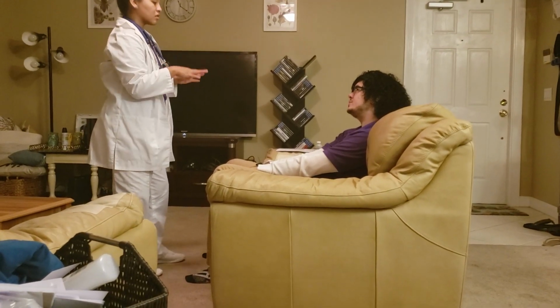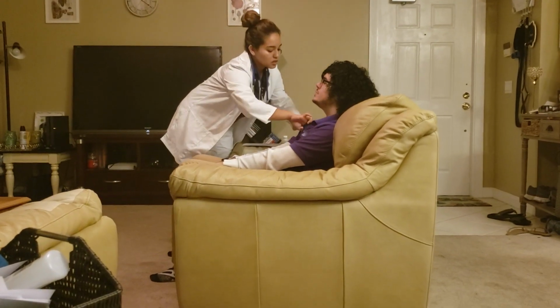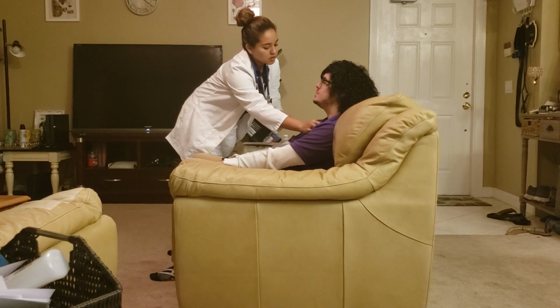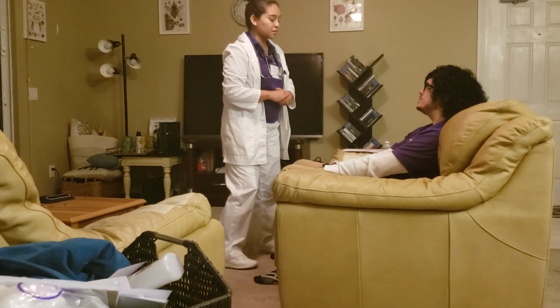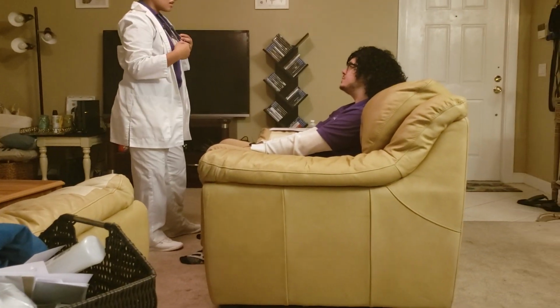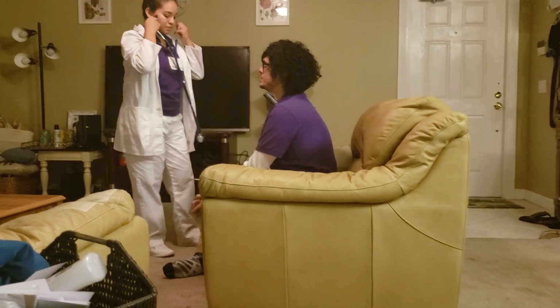limits. So I'm going to go ahead and move on to your chest and inspect your chest and skin turgor as well. Chest is normal, symmetrical, and skin turgor is normal as well. There's no signs of tenting. So we're going to go ahead and move on to your heart sounds and lungs. So if you could please sit up for me. I'm going to go ahead and listen to your heart sounds.